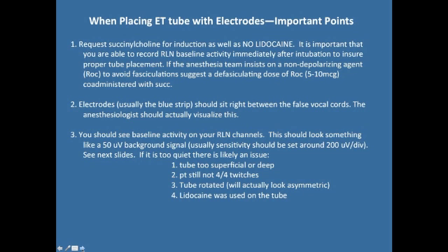Unlike your spinal EMG, you should have background activity. And that's going to confirm that the electrodes are against the vocalis muscle. The tonic resting state of the vocal cords is contracted. All right, so that muscle at rest, if you will, when you're not speaking, is actually contracted, not resting. The muscle only relaxes as you speak. So you should see activity on the cords.